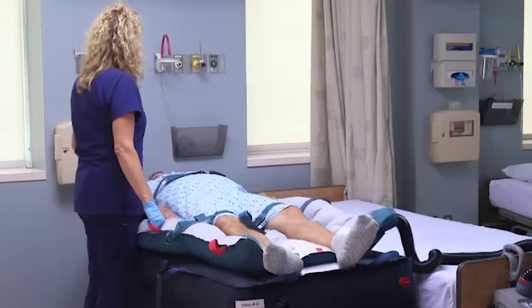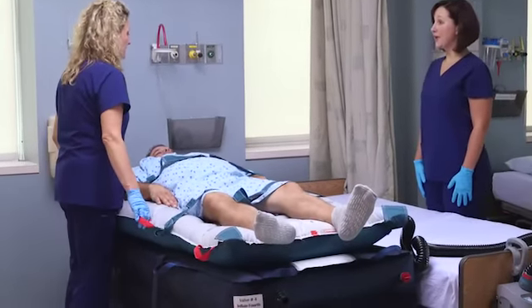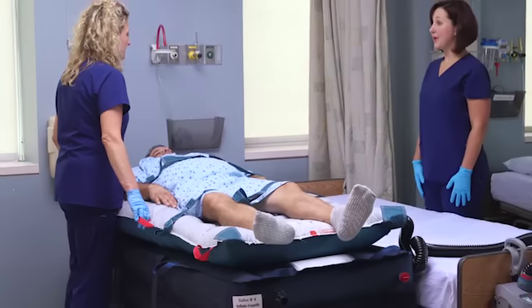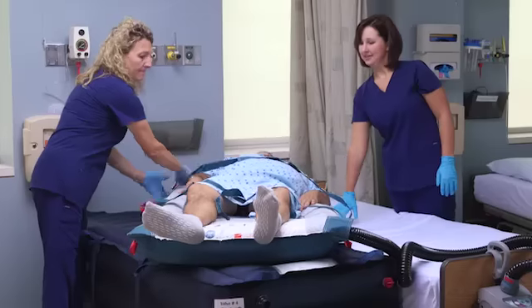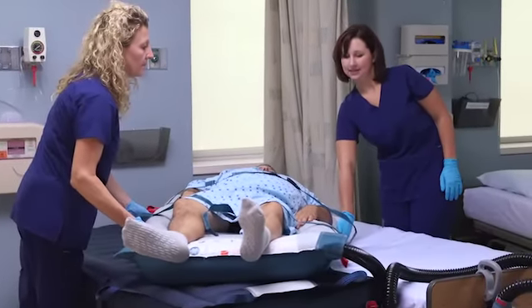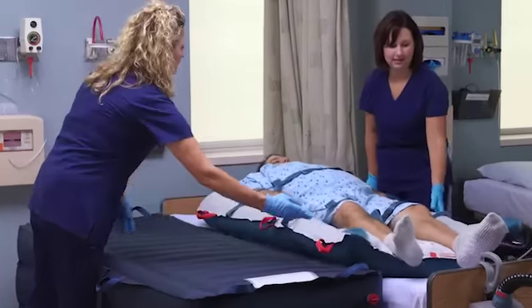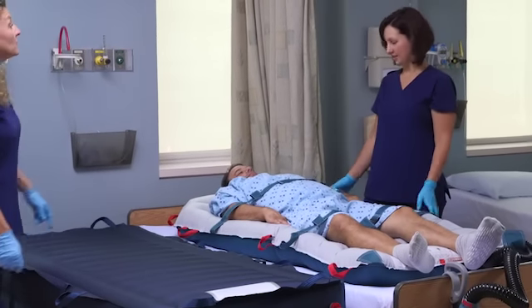The caregiver at the patient's side will keep his or her body firmly against the inflated HoverJack during the lateral patient transfer to avoid any HoverJack movement. The same caregiver will then initiate the patient transfer by gently pushing the inflated HoverMat at an angle toward the receiving caregiver, who has moved into position on the opposite side of the bed or stretcher. The receiving caregiver grasps the HoverMat handles as they approach to pull the patient fully onto the receiving surface.